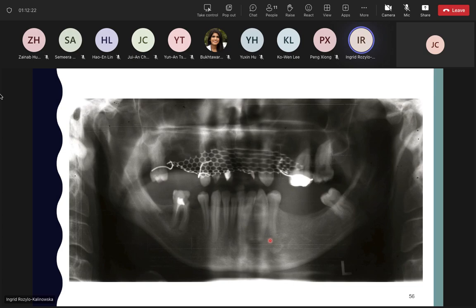And the second group of patients is very nice looking middle-aged ladies who think that if they take out their removable prosthesis, they will start looking like an old granny. So they leave the prosthesis, the denture, in place, and then they think that nobody would notice. Unfortunately, we do notice. That's a pretty bad shadow of a removable denture.